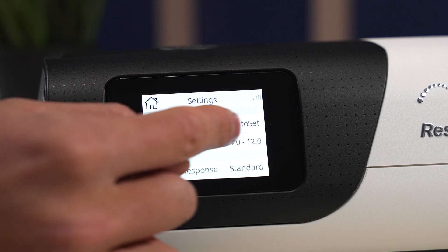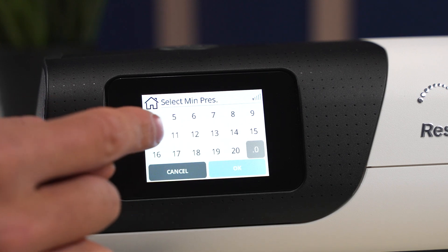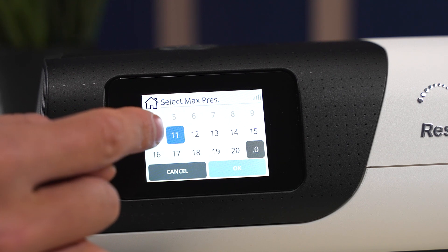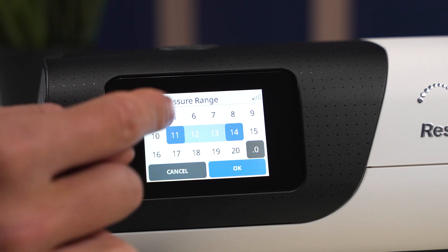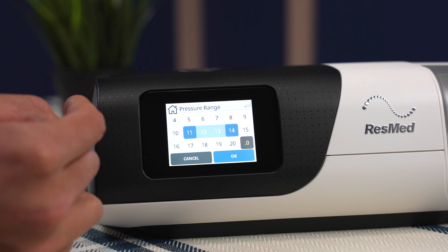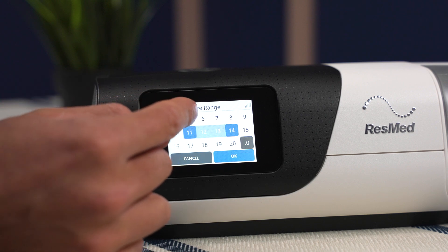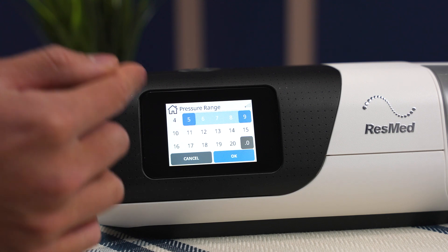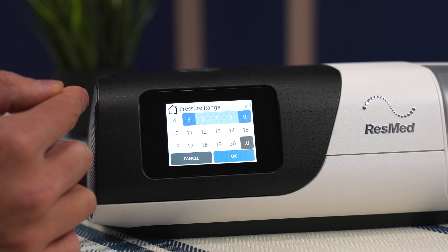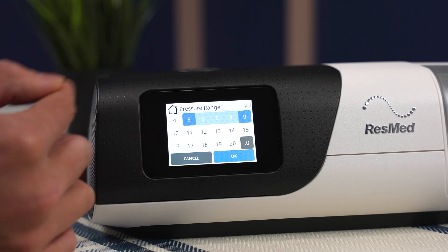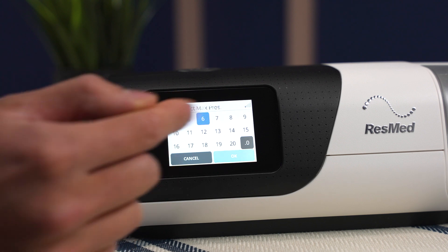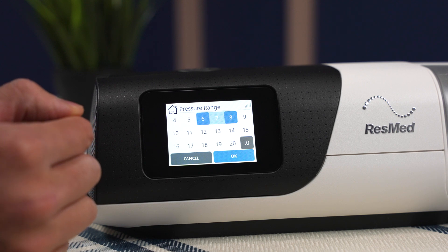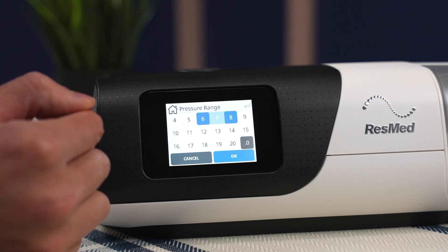Now we can see the pressure range is from 4 to 12. You can change the pressure range just like so — almost looks like you're booking a flight. So if you know your optimal pressure is a 7, for example, you might want to go from 5 to 9. Sometimes if the pressure range is too wide it'll fluctuate a little too much and might wake you up, so maybe you'd go from a 6 to an 8 so it's a little closer together and doesn't fluctuate as much throughout the night.